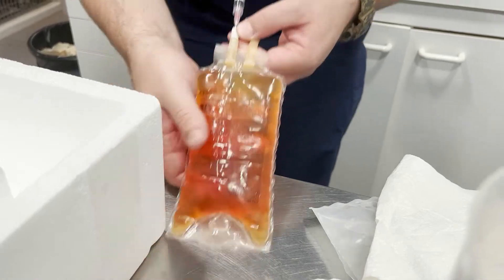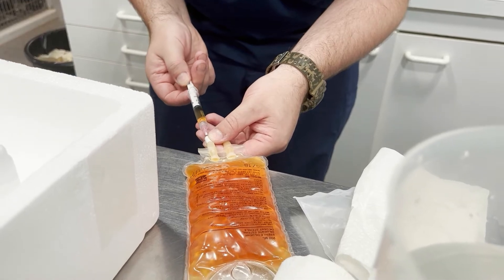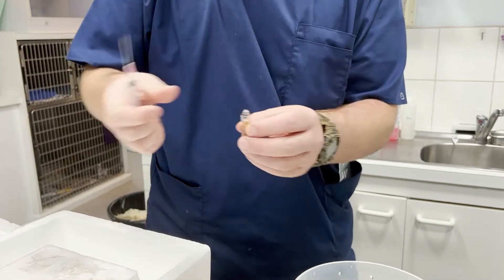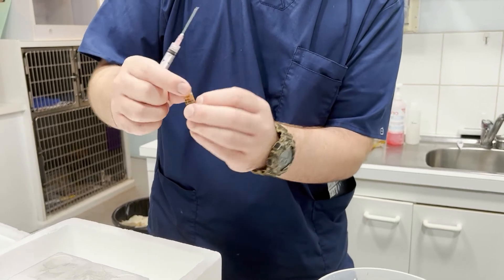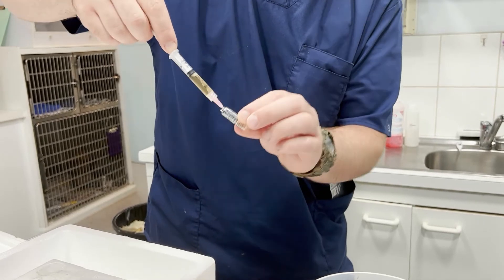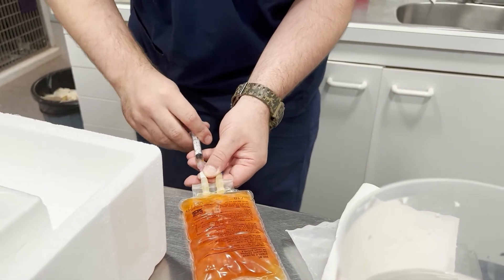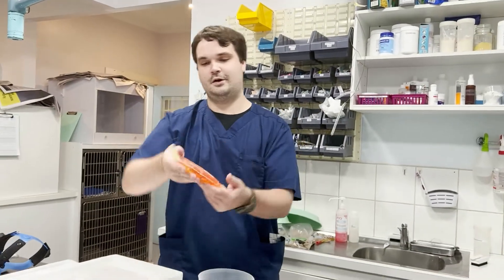Give it a quick little shake. We want to draw up a little bit more, because there's a tiny bit left over in here that we don't want to lose. Just to give it a quick rinse, get all we can out of this, pull back up, and inject the rest back into the bag. We want to mix it thoroughly.